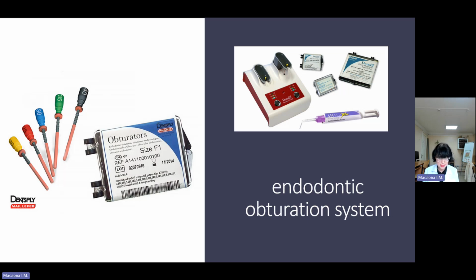can seal the entire root canal. They prevent microleakage and the reinfection of the root canal. Over time, sealers and gutta-percha have become the standard approach to obturating root canals. Sealers are needed to seal the gutta-percha core material and prevent microleakage. In the absence of sealer, gutta-percha cannot adequately seal root canals and prevent microleakage and reinfection.